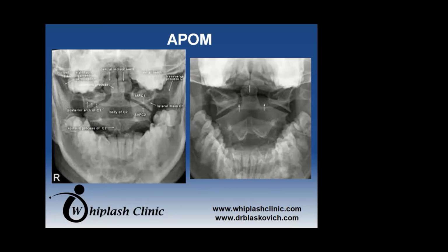And the same thing with the dens itself. The dens, or the C2 itself, the dens is about, I would say, 1.5 inches, 2 inches from the C2 spinous process. And so even if just C2 is rotated, the dens and the A-frame won't line up. But in this case, what you see is the two incisors, and the split between the two incisors literally splits the difference between the dens. And then you go down and you've got the A-frame is also dead center of all that.